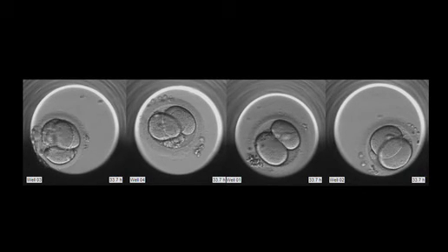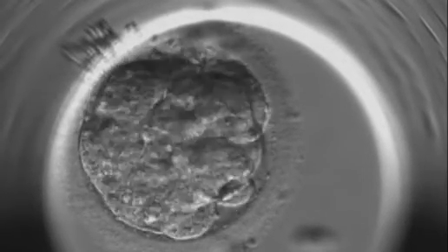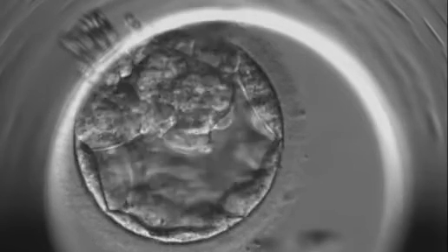This is time-lapse. Here you can see an embryo developing until blastocyst stage. Selected embryos that have been grown in the lab are selected for transfer.